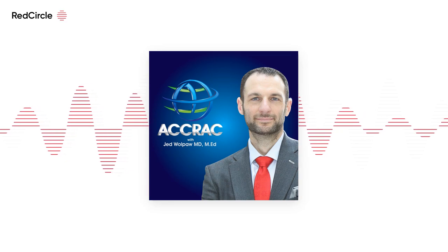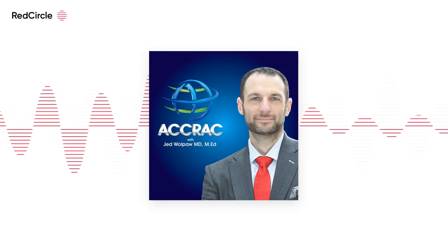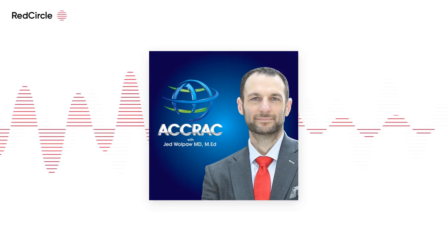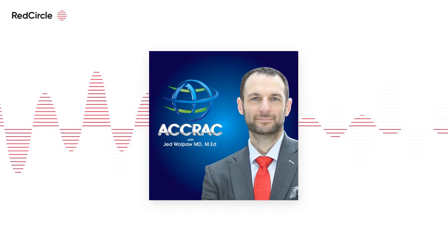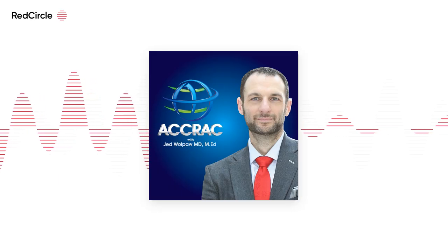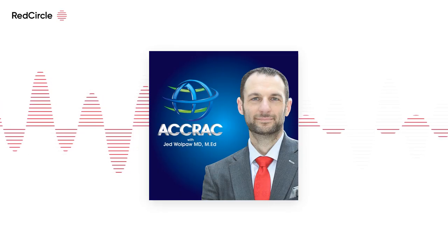So that's one method, if you have the tools. The Hamilton ventilators have a PV tool, but it increments pressure by 2 to 3 centimeters of water. So you may miss the accuracy of where airway closure is occurring because it jumps up in 2 to 3 centimeter water increments. You'll still see an inflection, but where the actual airway closure is becomes complicated and can make driving pressure calculations a little more complicated, unless you're ventilating above the inflection point, and then you're fine.